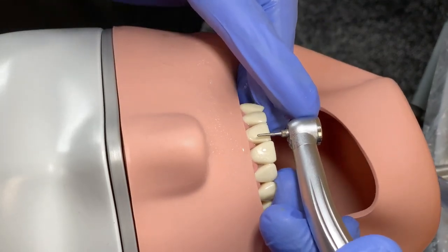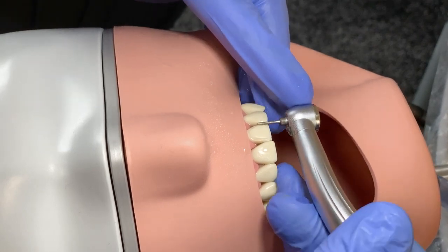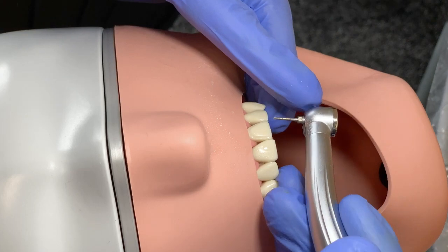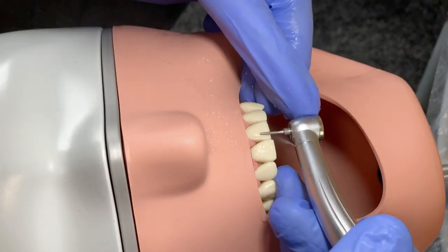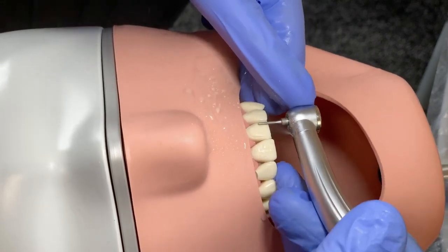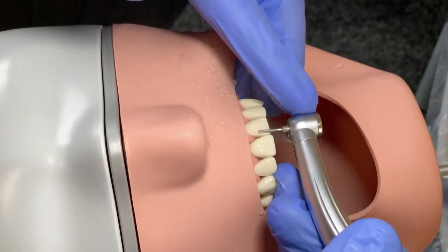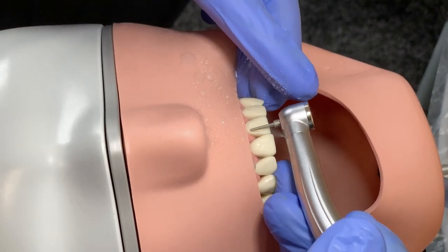If you are just starting to practice, always make sure that you are cutting only when you go in one direction. Do not cut both going and coming back, because every time you touch the tooth you cut from the tooth structure, and we are restricted to 0.5 to 0.7 mm. So use wash-away cuts. Whenever you cut from one area, make sure you cut from there consistently — all together.